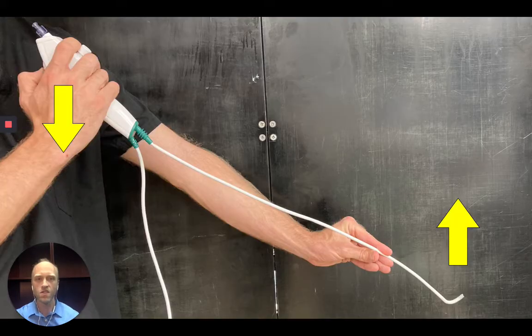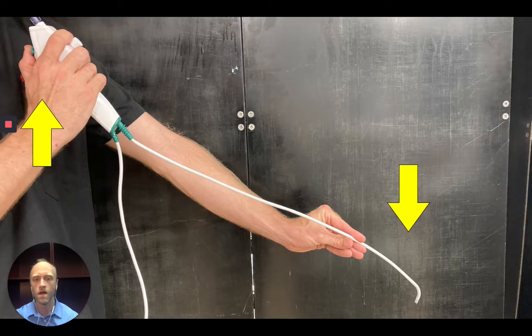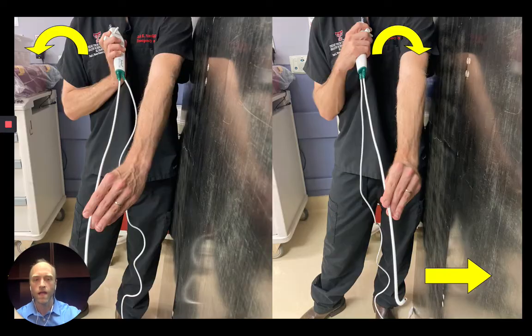The basics to driving the scope are quite straightforward. To direct the scope up, press the lever; to direct the scope down, elevate the lever; and with the lever engaged, twist the straight scope to either side in order to direct the scope to the right or to the left.